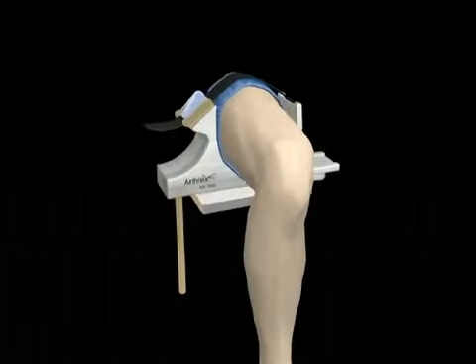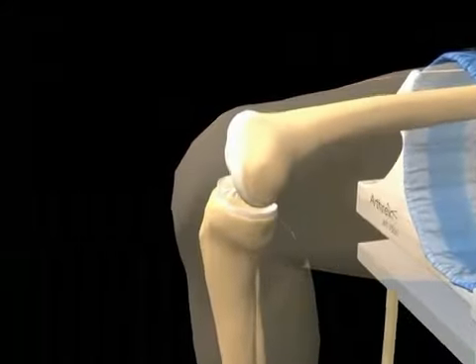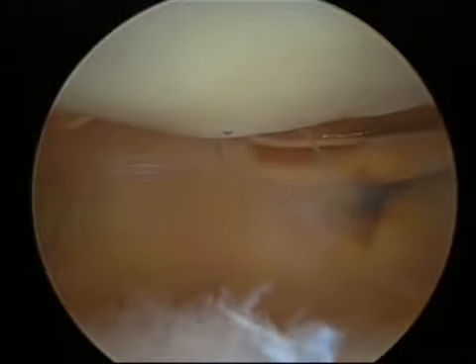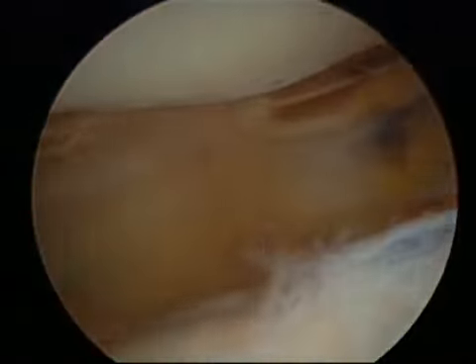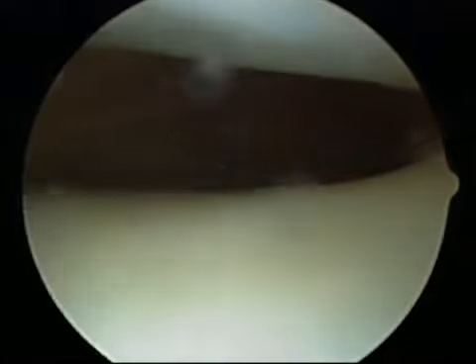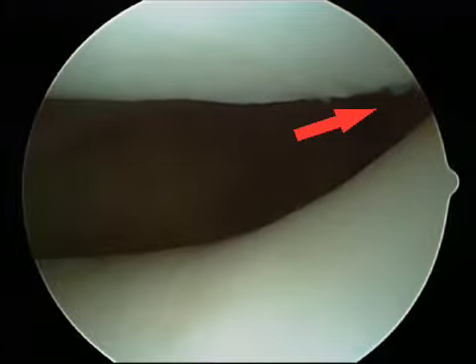Let's take a quick trip through a relatively healthy knee joint and point out some important structures. This is a knee joint filling up with arthroscopic fluid to inflate the knee joint for better visualization. Note the air bubbles at the top. The white structure at the top of the screen is the undersurface of the patella, or the kneecap. As the knee is bent, you can see how the patella presses on the end of the femur, or the trochlea.